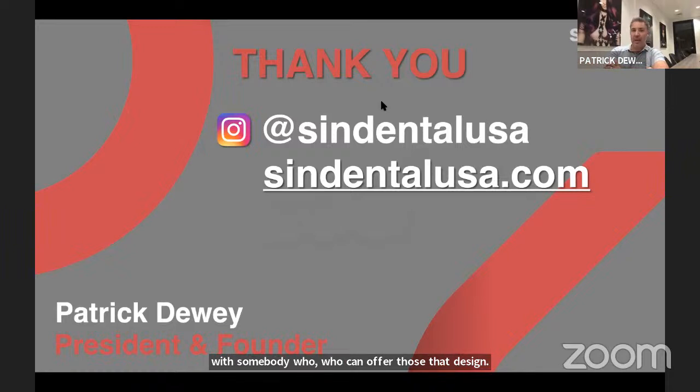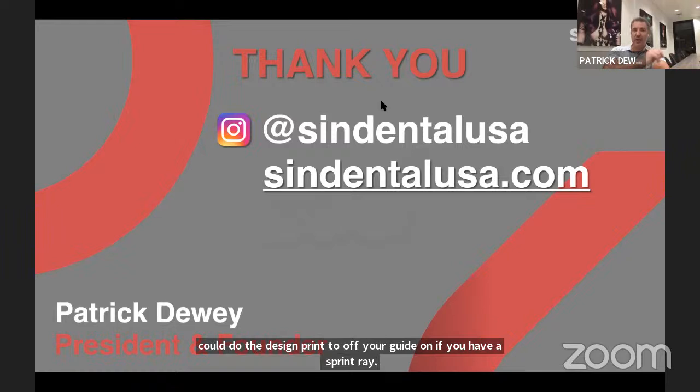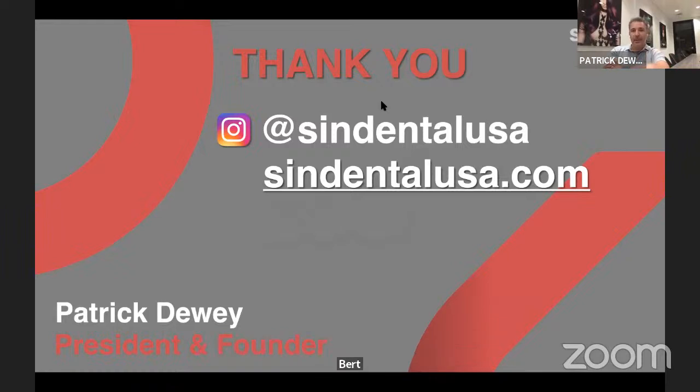Sprintray even has a design software where you can actually just do an AI design. And then they can print off the surgical guide. They can print off the temporary. So everything is good. You can print off your bone reduction guide there. I don't know their cost right off the top of my head, but I can't imagine it's more than $100 for a surgical guide design.